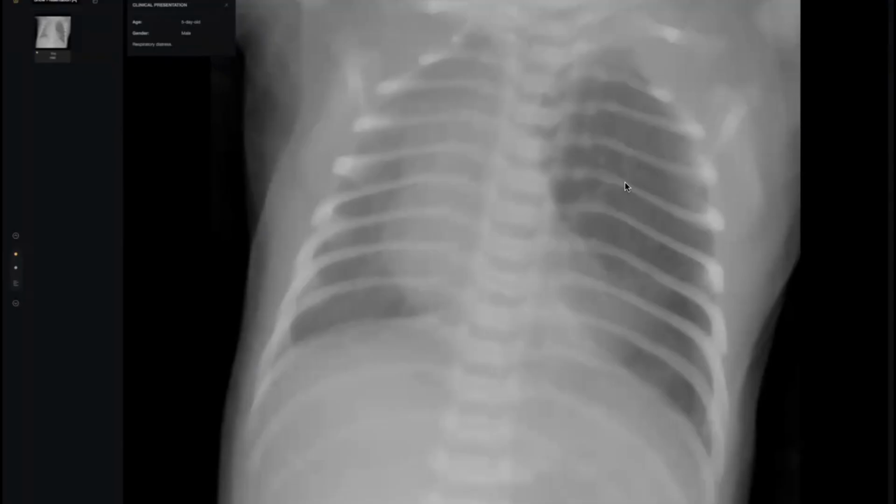Before I start this case, there is a very common sign during the ultrasound to rule out deep pelvic endometriosis. This sign is called the sliding sign. You make some gentle pressure with the vaginal probe. The uterus should move up and down with you.